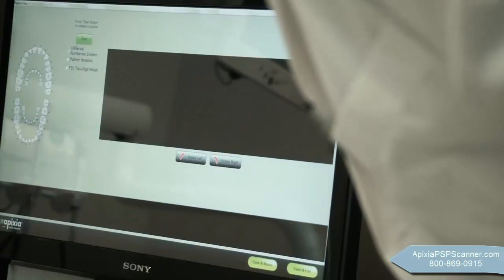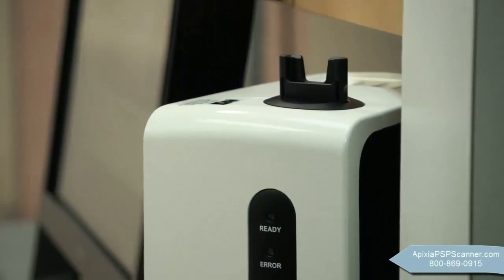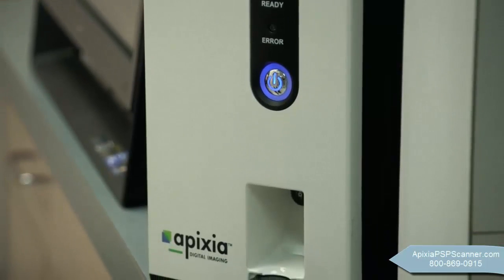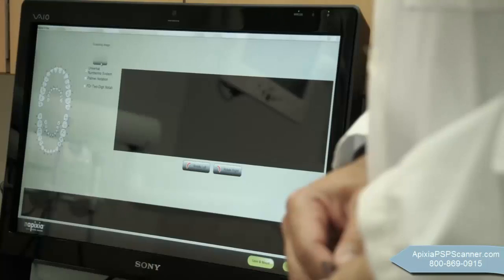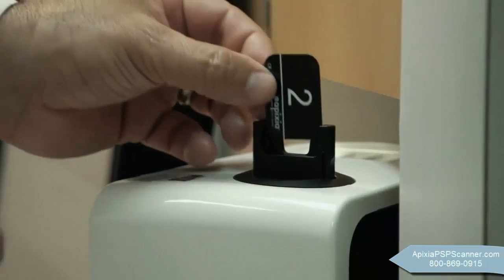Imaging is fast and simple. The smart top-loading design allows a quick and simple operation. Clear diagnostic radiographs appear on the computer screen, ready for viewing. Simply insert the next exposed plate when ready.